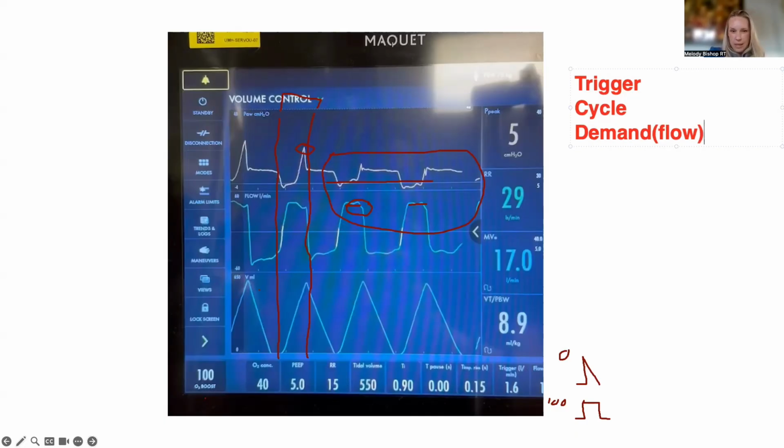as well, with that decay in flow that you're seeing in that waveform. So it looks like all of them. In the expiratory flow? Well, in the inspiratory, when it notches down, and then you see the increase in pressure. What do you think, Nick?